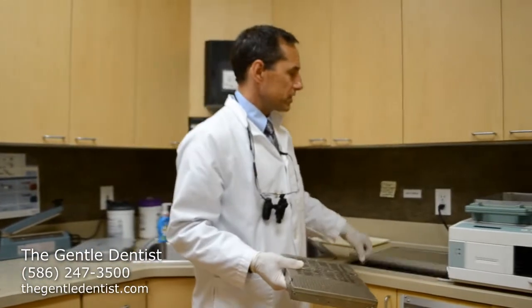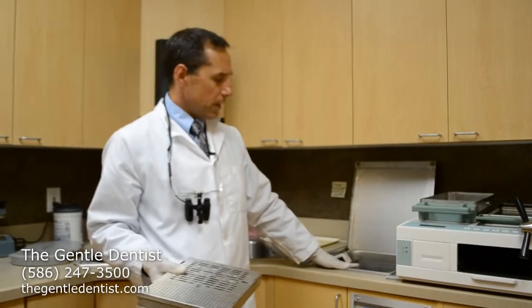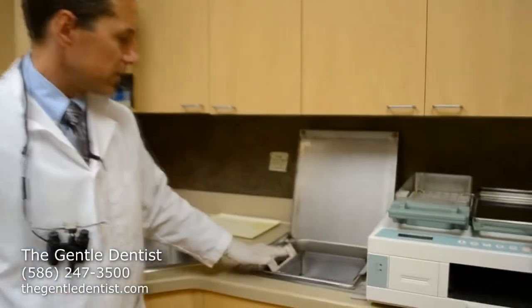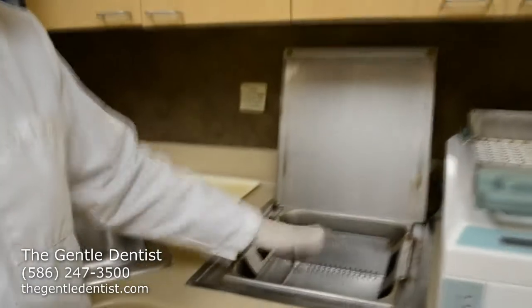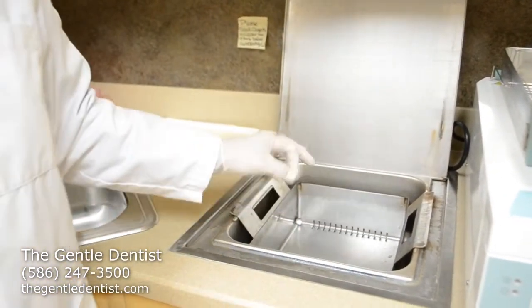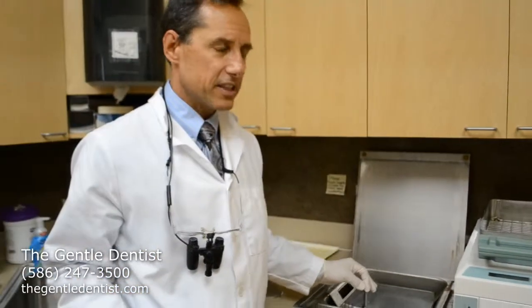Then we come over here, and this is called our ultrasonic. This is really an important thing. The instruments are submerged here, and it vibrates and shakes them, and it microscopically removes the blood, the saliva, and things like that. It removes the gross amounts of that material, so that when it is sterilized, it's clean.